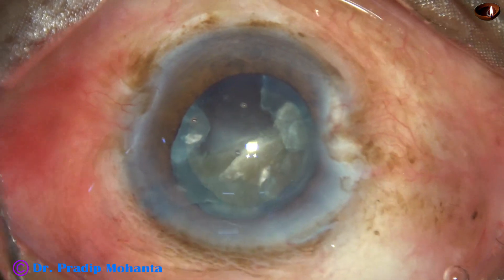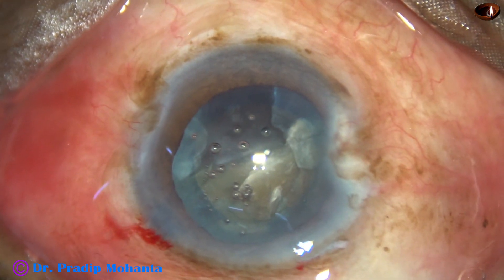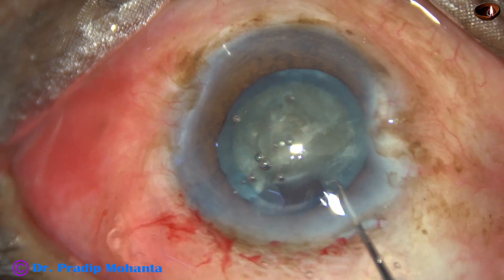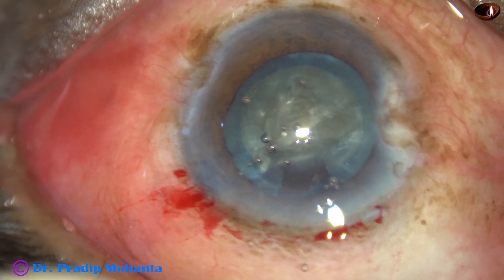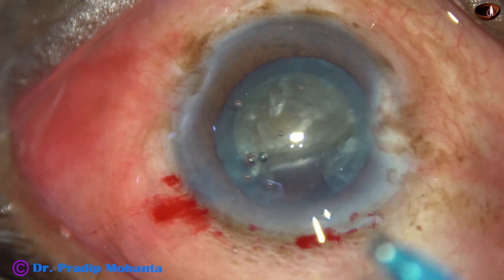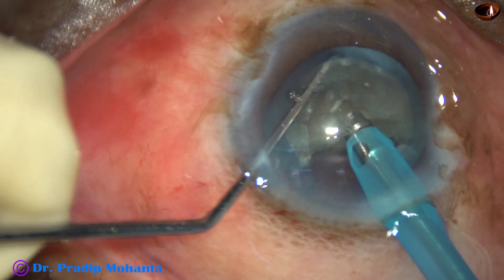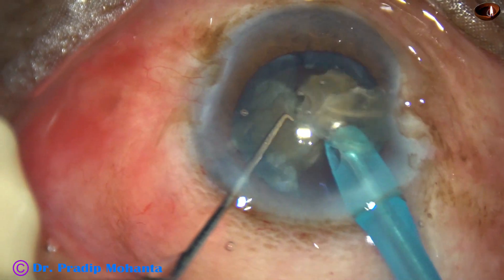Now here I could not rotate the half towards 12 o'clock, so I inject Visco and take two hooks. Bimanually, I rotate this hemi-nucleus and then go again with some more Visco. The phaco tip goes in and I chop this hemi-nucleus into two halves, and then each portion is emulsified.